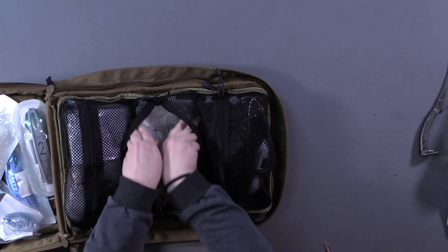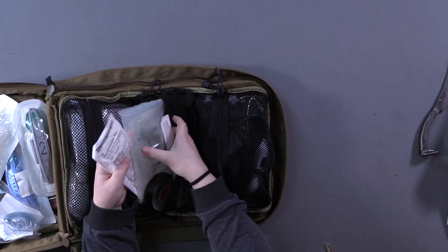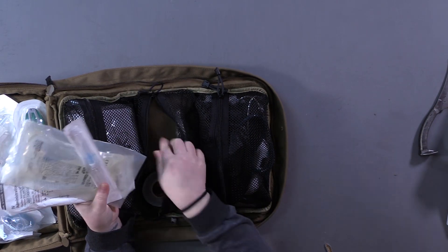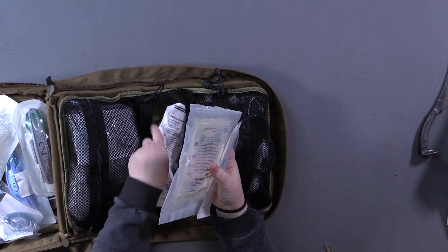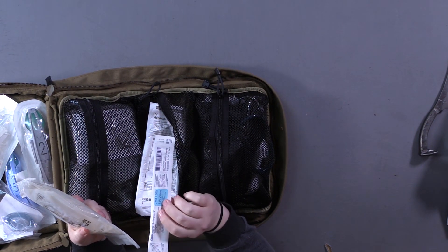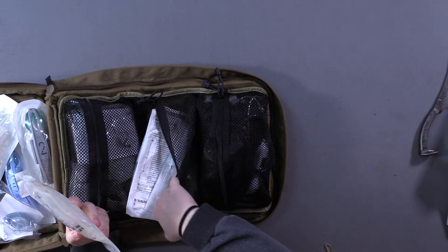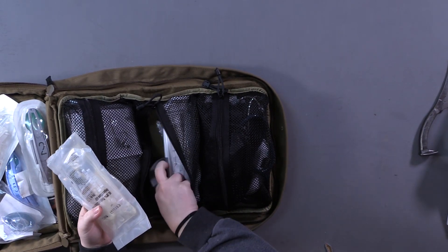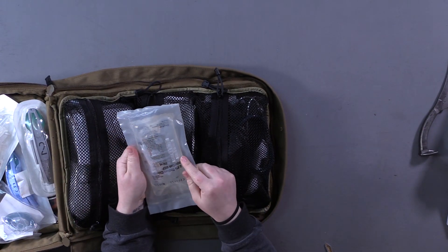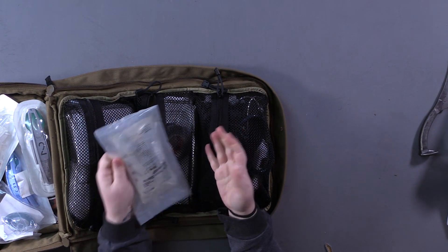In this next pocket we have IV stuff — just a little flush, an IV start kit with a 20-gauge or 22-gauge needle. The higher the number the smaller the needle. We also have some little duct tape and a small bag of regular saline.